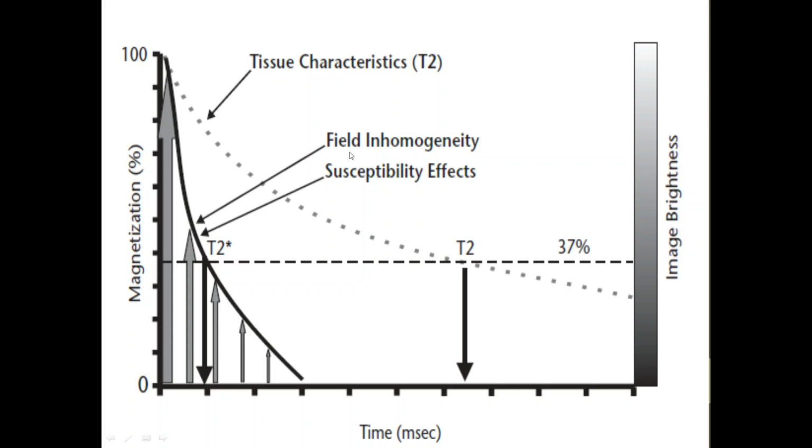Susceptibility effect. Field inhomogeneity: you will find the magnetic field is not homogeneous, causing the protons to dephase. After a certain time they will be in different positions, so the protons' magnetization neglect each other, causing magnetization loss of protons in XY.